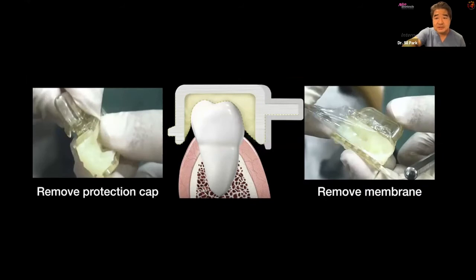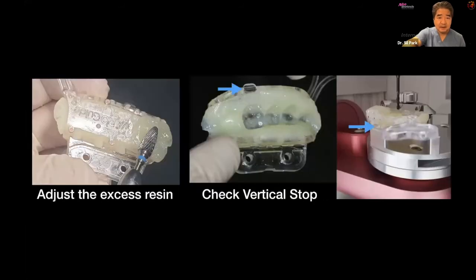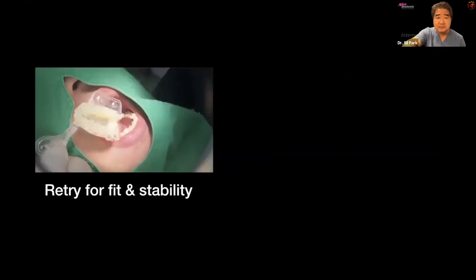Once you remove the jig, you can see on your right side there is a clear membrane. So you have to remove it. But sometimes the membrane is quite sticky and becomes one body with the resin, then you can leave it alone. That's also fine. If there's any excessive resin on the posterior area, you can grind off a little bit, and then you're going to put it into the milling machine and begin milling the guide.